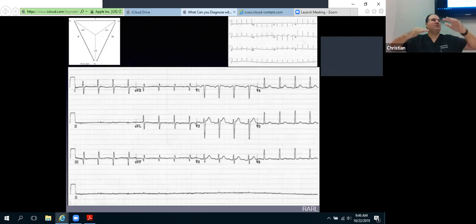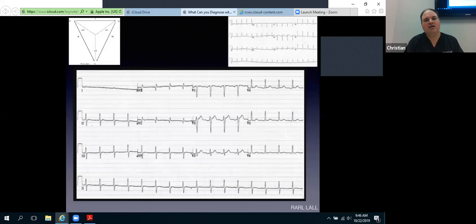And so there's no electrical difference between them, therefore it's a flat line in lead 2. So that's how we know when those two have been reversed. If you do right arm, right leg, left arm, left leg, it's the same thing with the right arm, because now you're putting the left arm and left leg and right leg up here, and there's no difference that they're seeing, so that flat lines in lead 1, because there's no electrical difference.